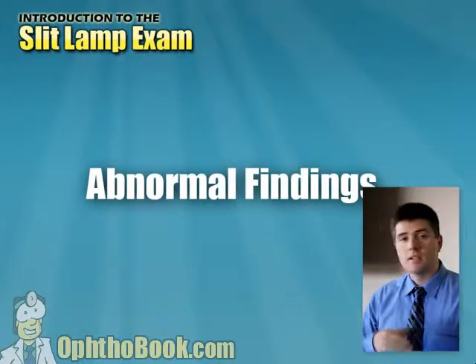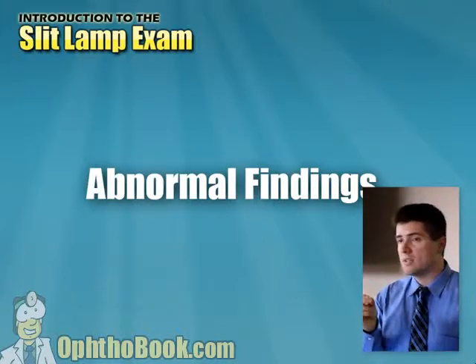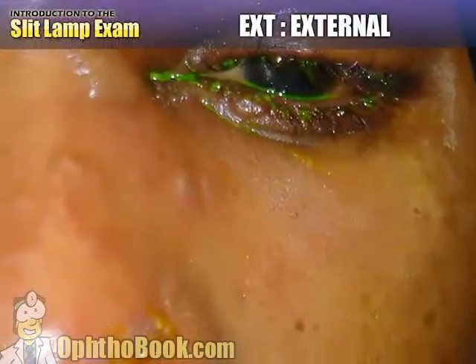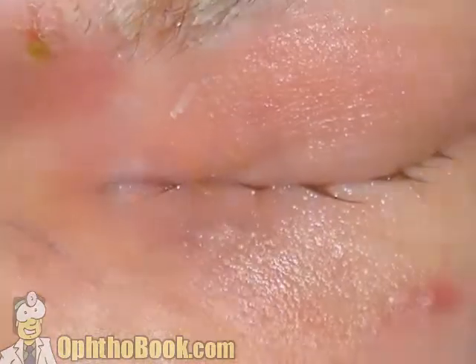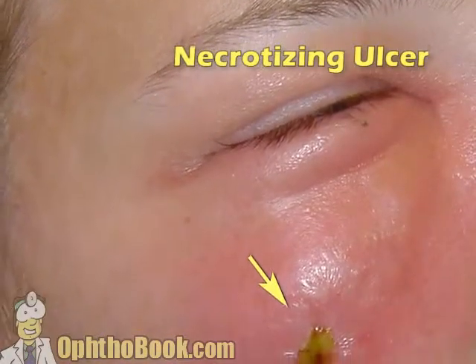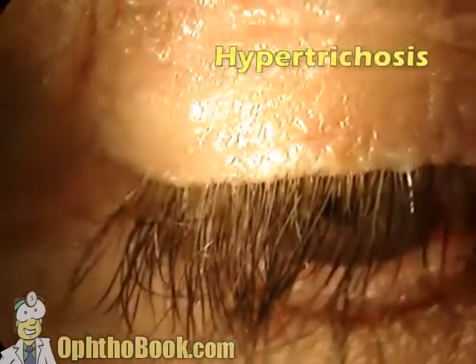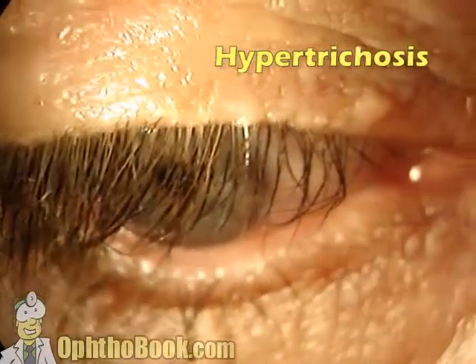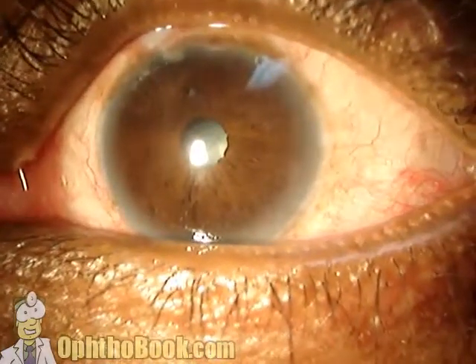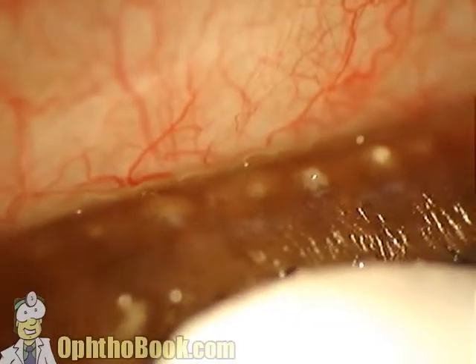Now let's look at these eight structures again but with a whole bunch of pathology. Starting external: this is Hutchinson's sign — a lesion you see with shingles on the nose, indicating higher probability of eye issues. This is a brow abscess, a pimple gone bad, creating a pre-septal cellulitis. And this is a necrotizing ulcer — believed to be from a brown recluse spider. For lids and lashes: these lashes look normal but note their sheer length — this patient has been on latanoprost for many years. Collarettes, scurf, and junk on the base of eyelashes indicate anterior blepharitis. Posterior blepharitis shows meibomian glands clogged — pressing with a Q-tip reveals whitish oily material oozing out.